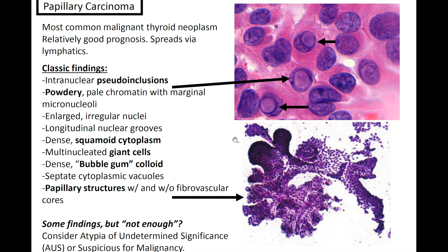Papillary thyroid carcinoma is certainly an entity to be familiar with. It's the most common malignant thyroid neoplasm, with a relatively good prognosis, and it spreads via the lymphatics. The classic findings in PTC: you're going to see intranuclear pseudo-inclusions, as we see here. You're also going to see powdery, pale chromatin with marginal micronucleoli, enlarged irregular nuclei, longitudinal nuclear grooves, dense squamoid cytoplasm, multinucleated giant cells, or dense bubblegum colloid.